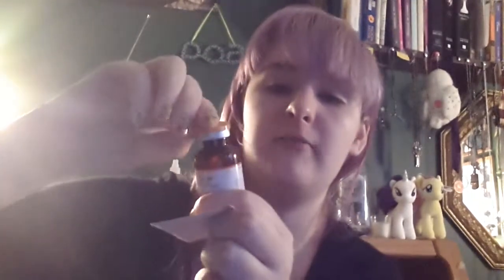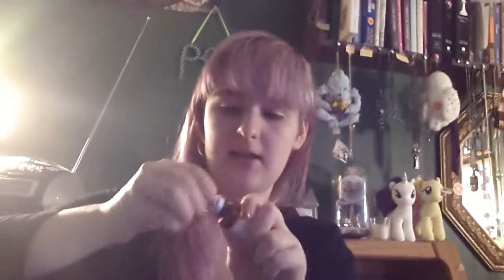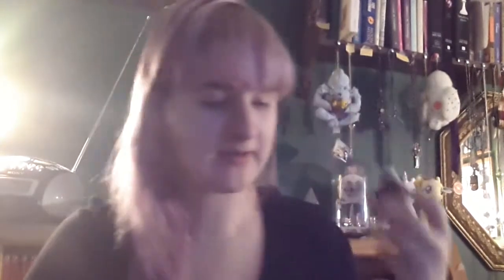Then you're going to grab an alcohol wipe and take the cap off your vial of medication. You can see the little rubber seal inside there. You're going to want to wipe that down, just like this, and wipe down that inside.